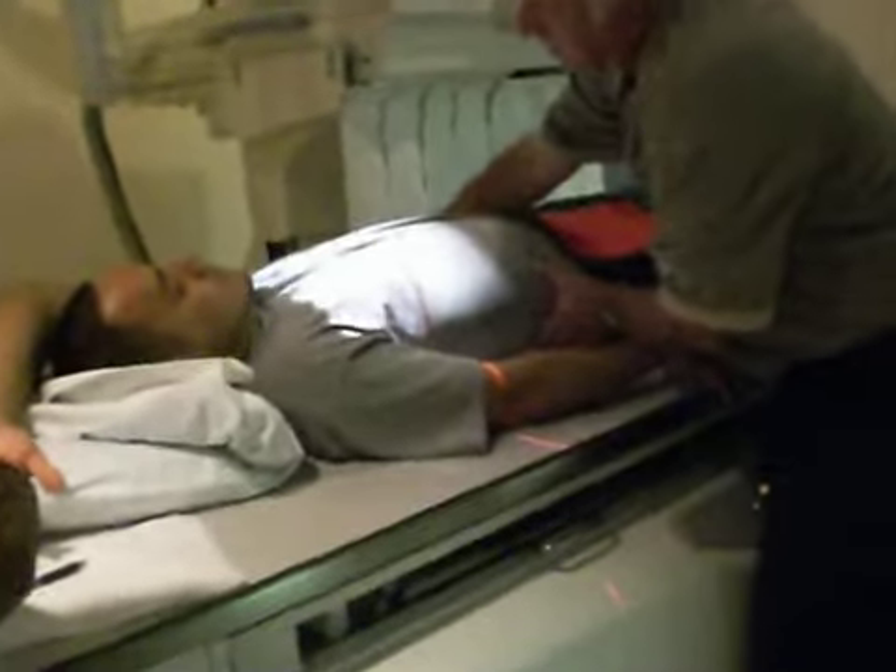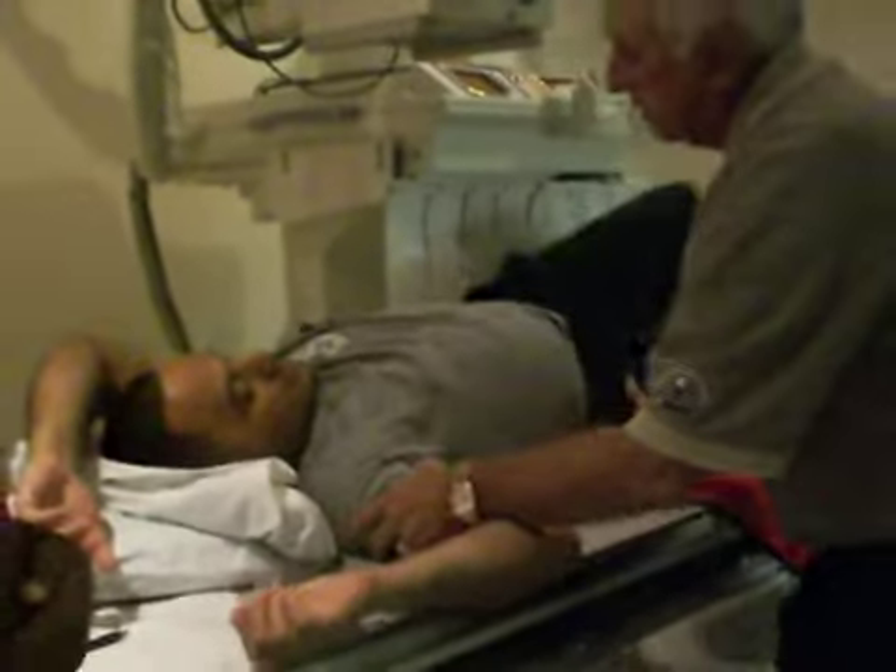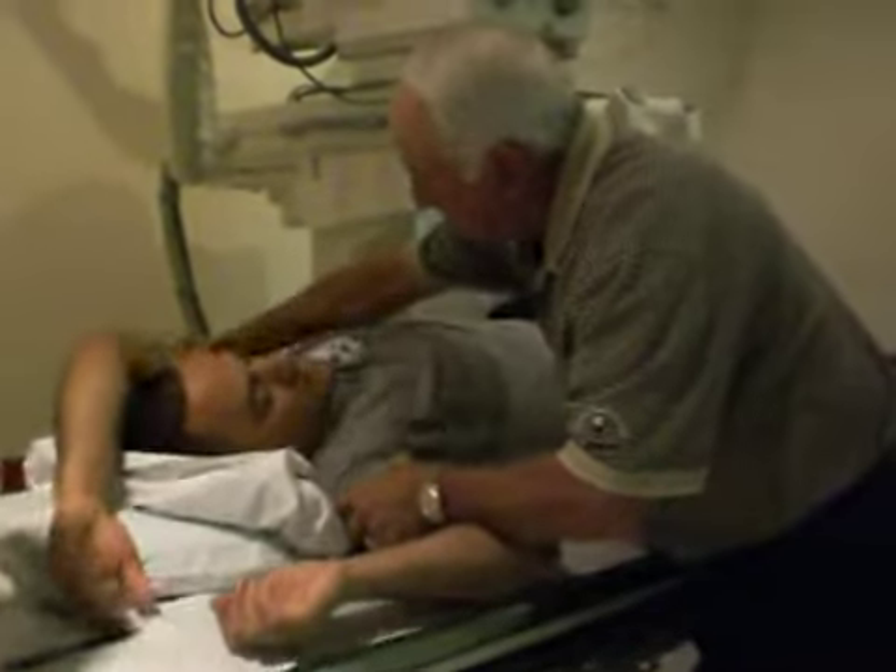So I'm going to scoot him over a tad, I'm going to bring this arm up, and I'm going to have him roll about halfway up on your side. Handling it up. And they're hurting. I'll pose it around there.